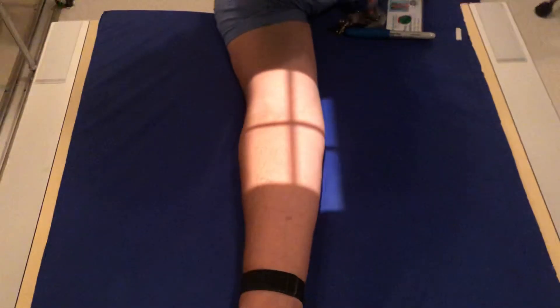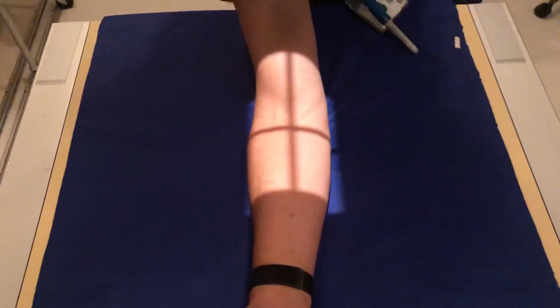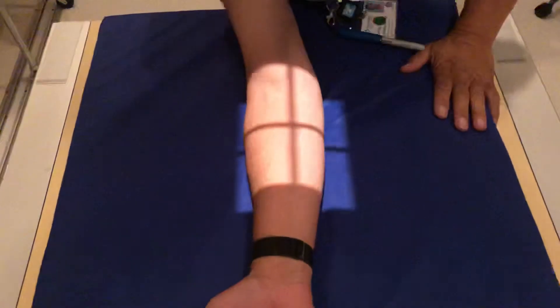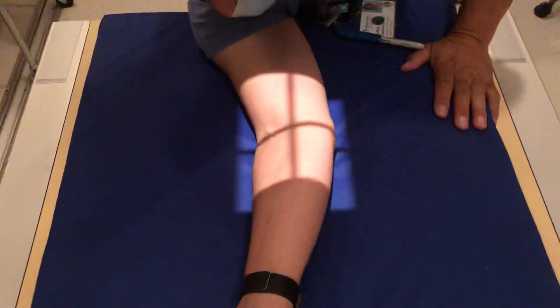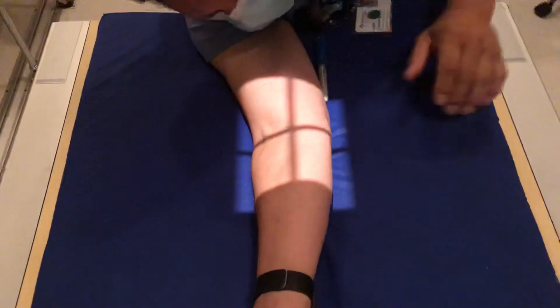That'll be your first view, right about there. The second view is going to be an external oblique, and the way that works is you're going to roll the patient out about 45 degrees this way, which will throw the radial head off the ulna.